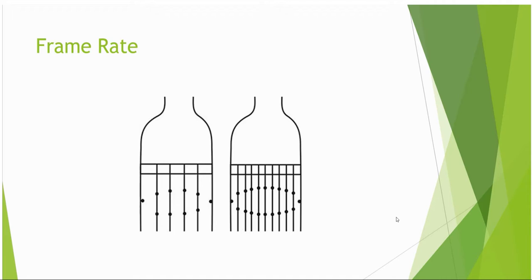A trade-off then exists between temporal and spatial resolution, and we must adjust settings to observe structures of interest, such as fast-moving cardiac valves will need high frame rates, while a rather static liver does not require high frame rate.